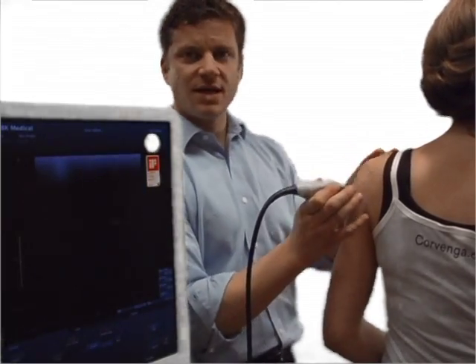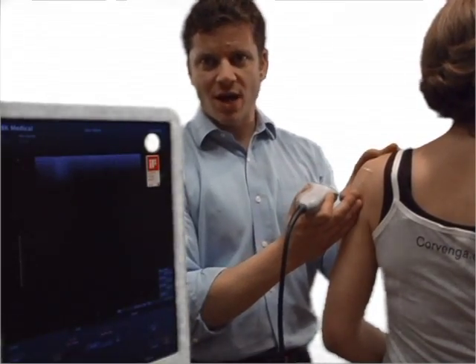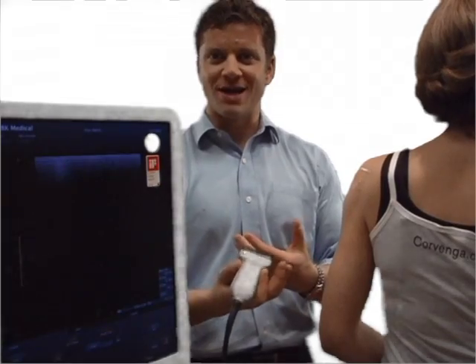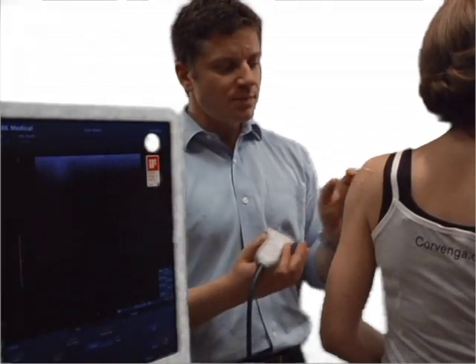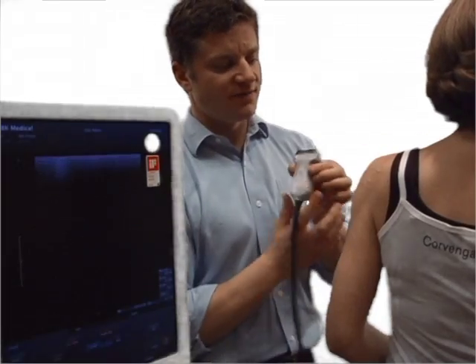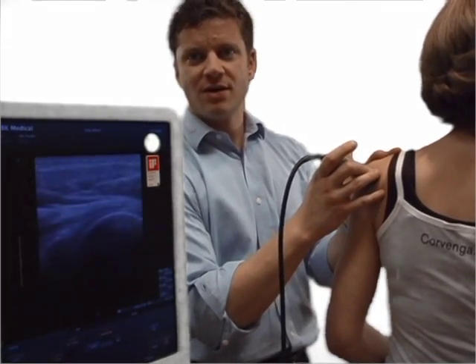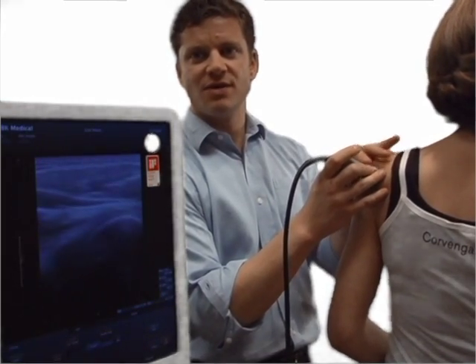One technique on a model like this — you can obviously see it quite well. But if you have a larger patient where it's not as prevalent, one way of finding the joint is walking off the edge of the acromion. As you dip down, most of the time you'll end up right on the joint, and that's the view that you want.